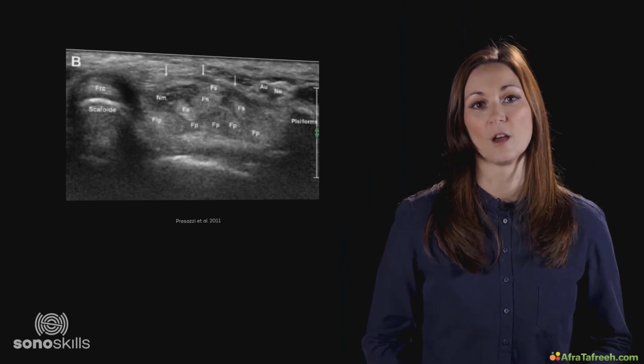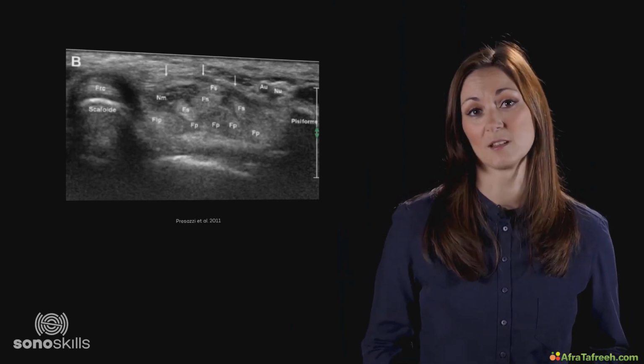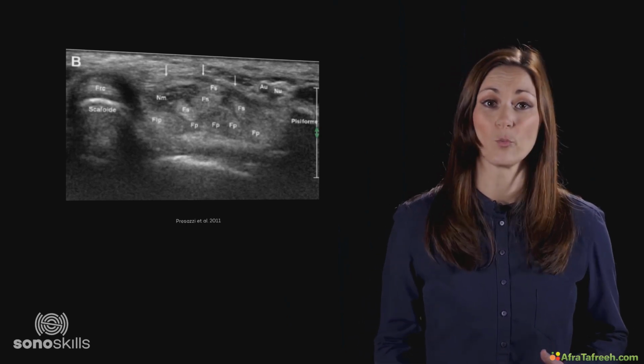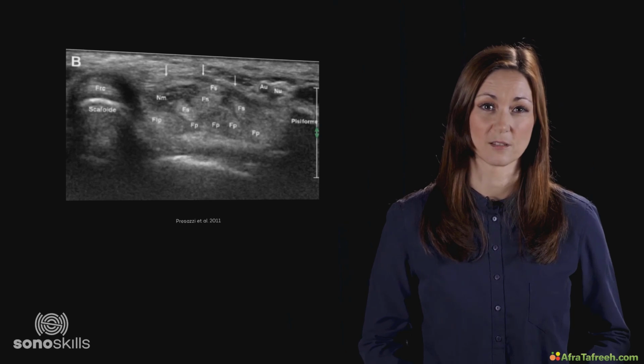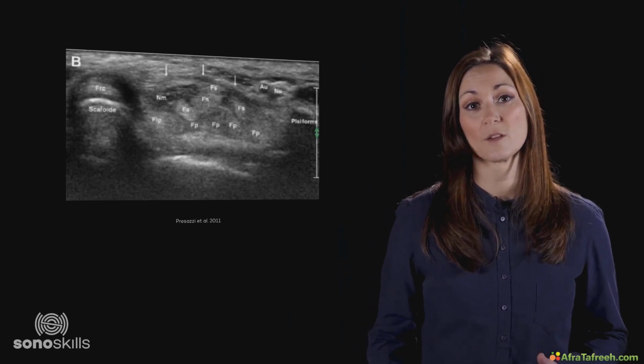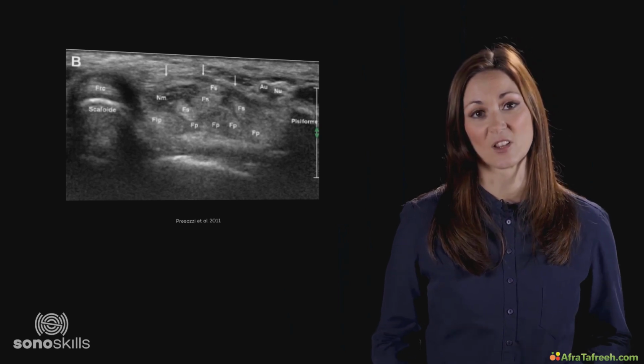This is an example of a nerve, to be precise, the median nerve in the carpal tunnel. The median nerve can be seen on top of the white-coloured flexor digitorum tendons. With ultrasound, one can observe the median nerve both statically and dynamically.